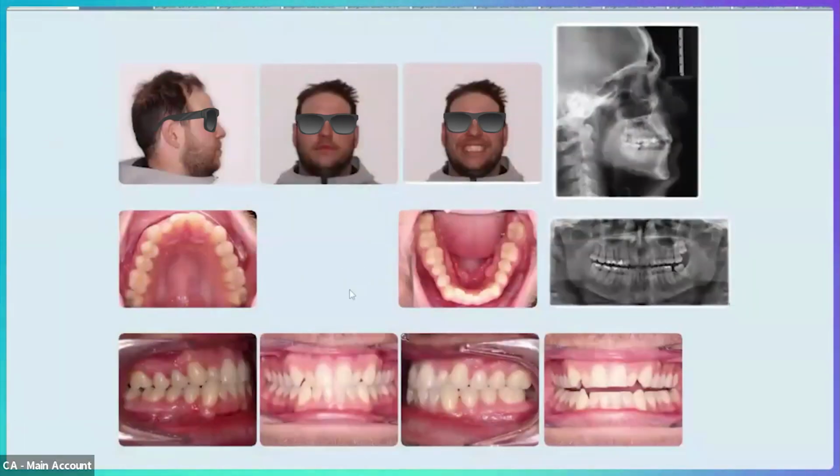All right, so this patient comes into our office, and this is an old case. I treated this patient 5 years ago now. And I'm going to show you that the techniques we used in this situation are still relevant. We still do the same things. But I will also point out anywhere that I would change protocols or techniques to make things more efficient.